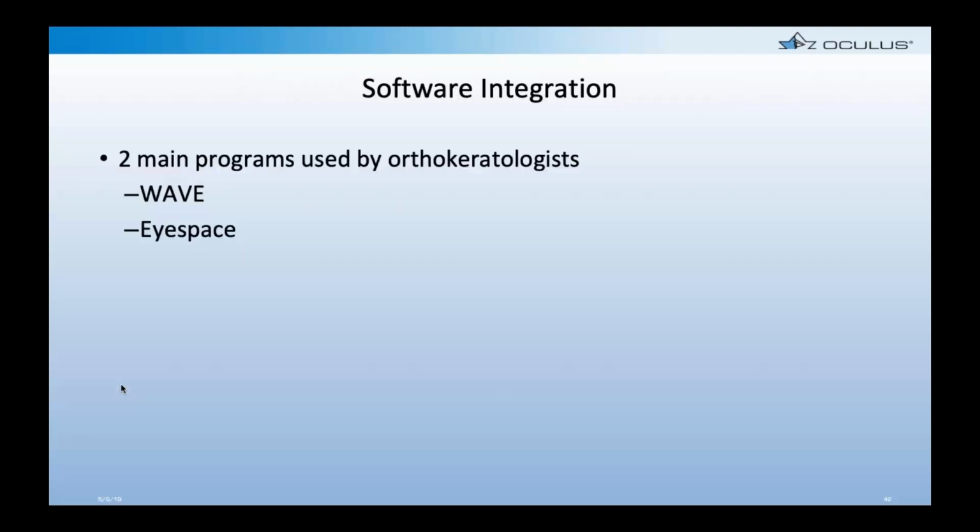So that's the keratograph instrument, again, on a very basic level, how we use it for ortho-K specifically. Our pre-treatment maps look at the patient's eye, make sure their corneal shape is regular, that they're a good candidate for ortho-K, and provide a baseline for comparison for future evaluations. We've also got the follow-up maps. We can do a compare 2, compare 3. We can see our treatment between one visit to the next. We can see the evolution of our treatment over time.